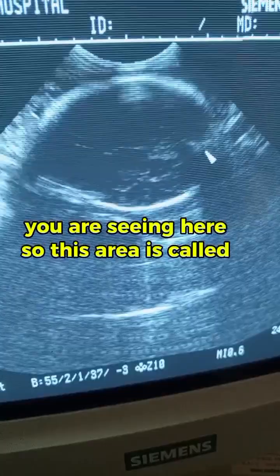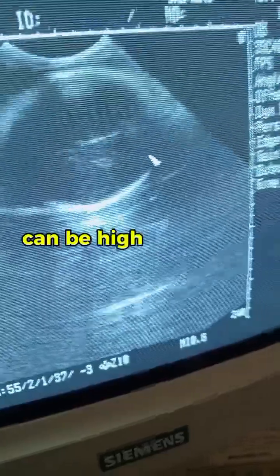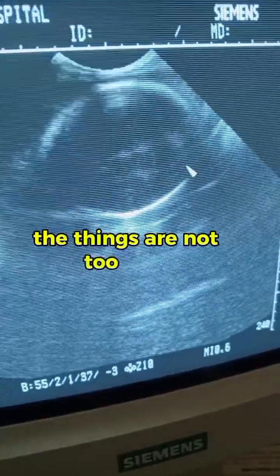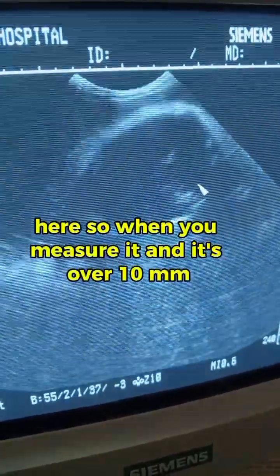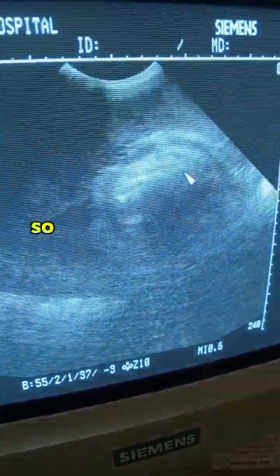Sometimes the fluid within this cisterna magna can be high. If it is high, it means things are not too okay here. When you measure it and it's over 10 mm, it is called mega cisterna magna.